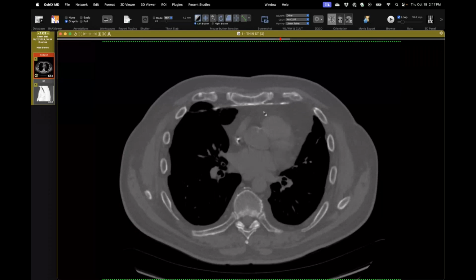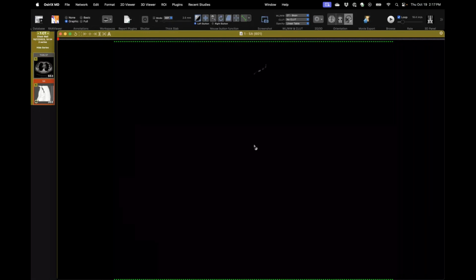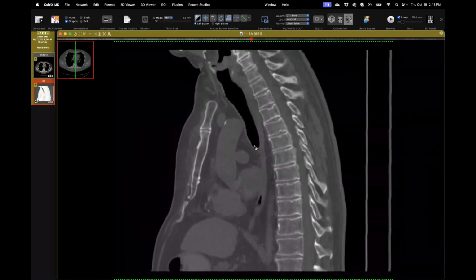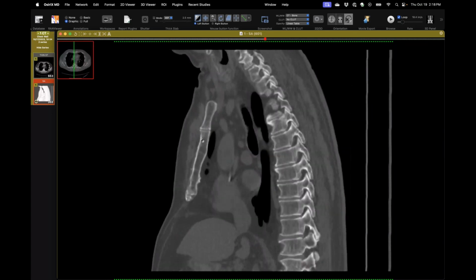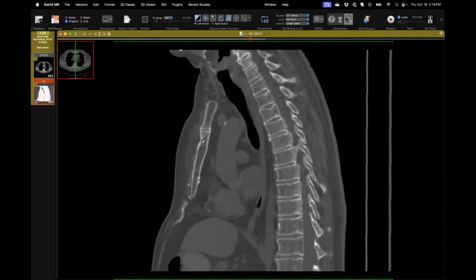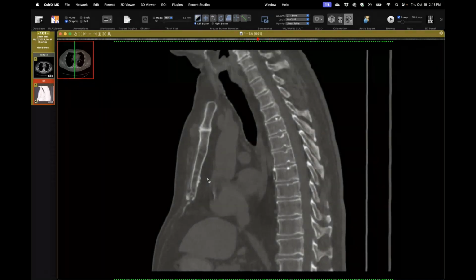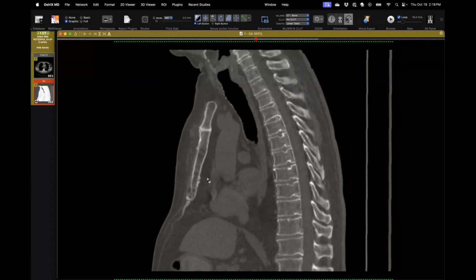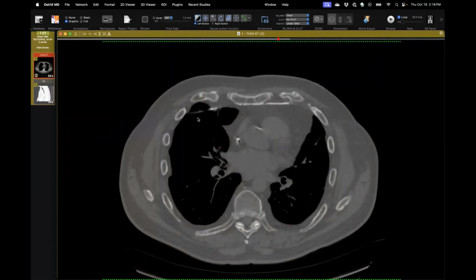It went across. And then if you look at the sagittal, right window there we go. You can see that his sternum isn't quite right. It's kind of bendy looking here. And if you look at where this passes by in there, it's classic of a Nuss procedure. Now he's 70, so it wasn't in the immediate chart, but I finally dug around a little bit. He had a remote pectus repair, but we don't usually CT them afterwards. So this is what it is.